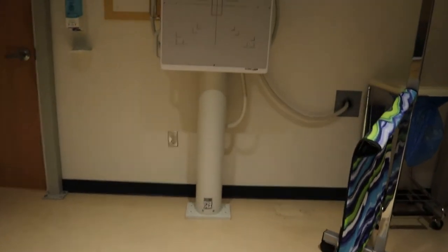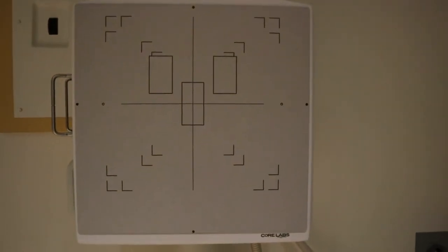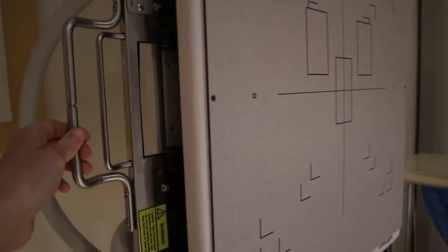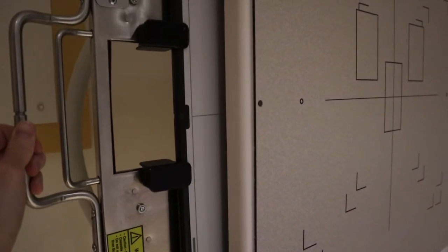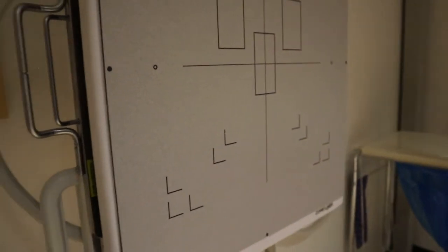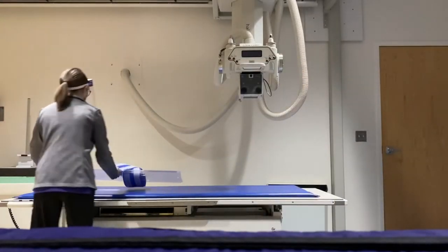Now I'm going to take you over to what's called a wall bucky. Here's the wall bucky. We use these for chest x-rays, upright abdomens, exams like that. There's a slide-out tray that houses the large image receptor. So anything done upright will be done there.